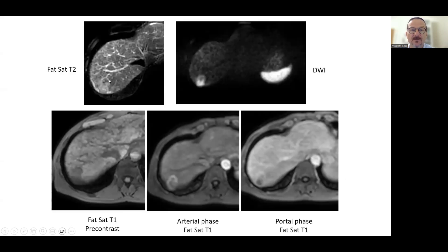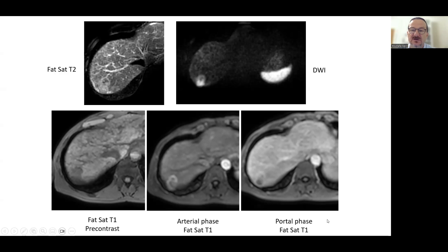Another tumor, hyper-intense when compared to the parenchyma, shows diffusion restriction. It is hypo-intense on T1, with early arterial enhancement and capsular enhancement, and central washout in the portal phase.